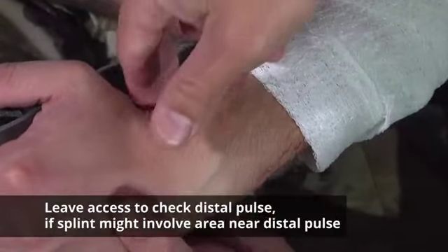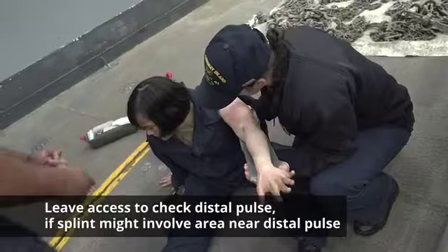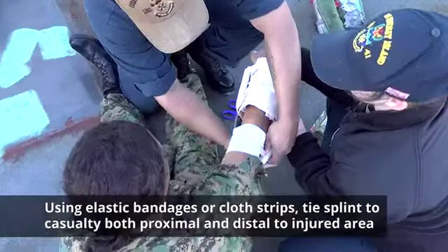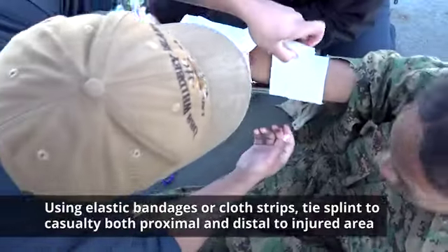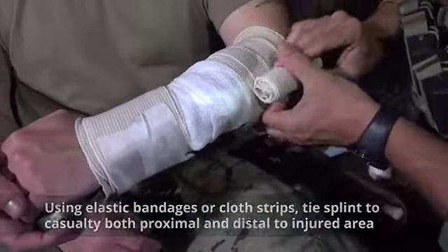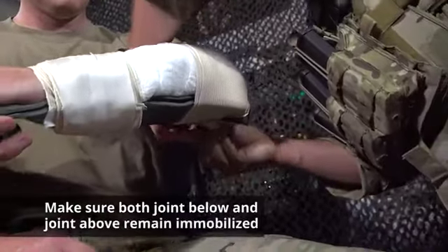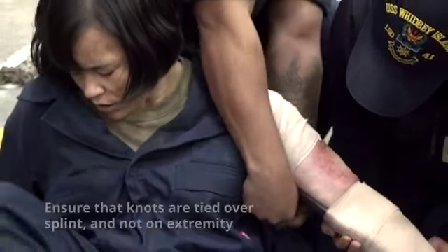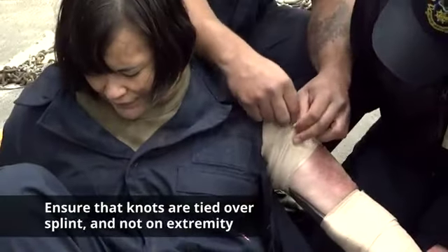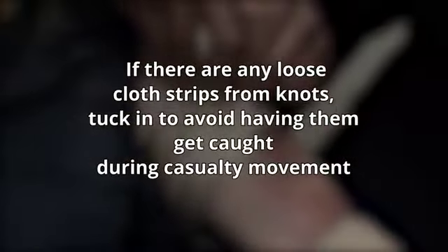Make sure to leave access to check a distal pulse if the splint might involve the area near the distal pulse. Then, using elastic bandages or cloth strips, like cravats, tie the splint to the casualty both proximal and distal to the injured area, avoiding pressure directly over the injury. Make sure that both the joint below and the joint above remain immobilized. Also, ensure that the knots are tied over the splint and not on the extremity. If there are any loose cloth strips from the knots, tuck them in to avoid having them get caught during casualty movement.